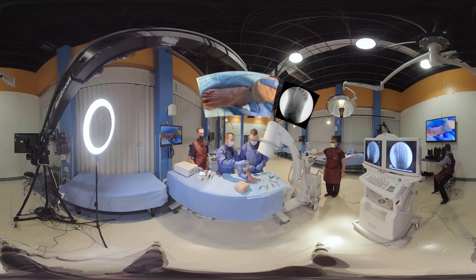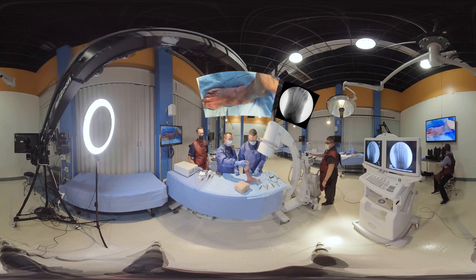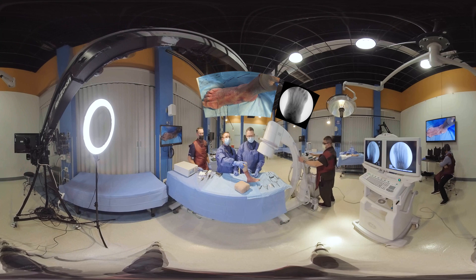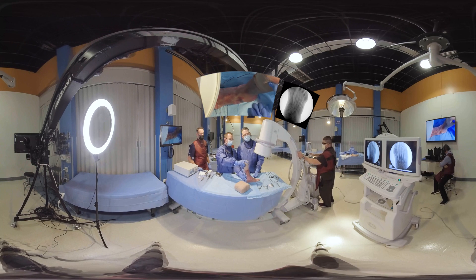This minimally invasive procedure, the mini bunion, is indicated for mild and moderate bunions. Not the severe bunions, but the mild and moderate bunions.